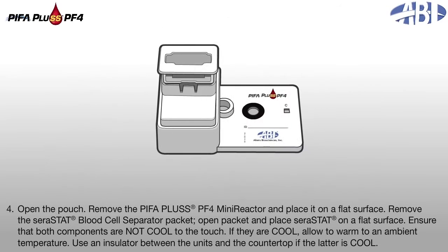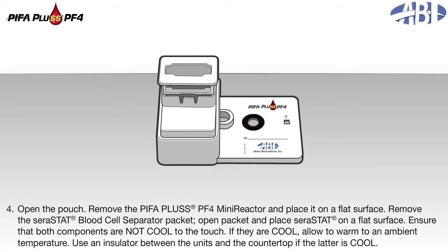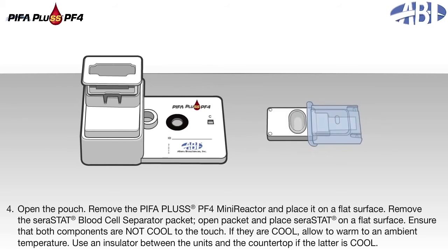4. Open the pouch, remove the PIFA Plus PF4 mini-reactor, and place it on a flat surface. 5. Remove the serastat blood cell separator packet. 6. Open the packet and place the serastat on a flat surface. 7. Ensure that both components are not cool to the touch. If they are cool, allow them to warm to an ambient temperature. 8. Use an insulator between the units and the countertop if the latter is cool.